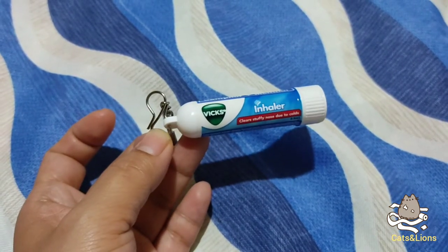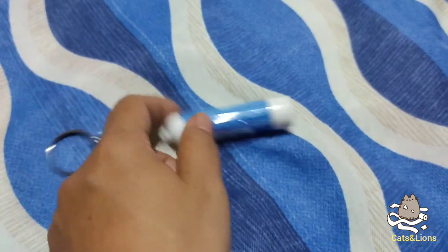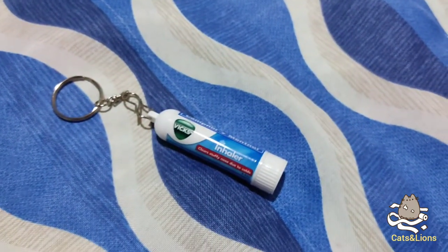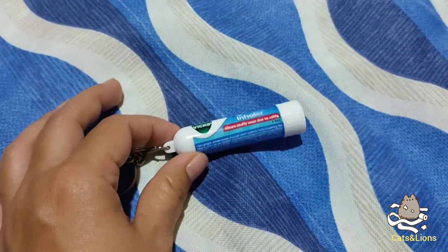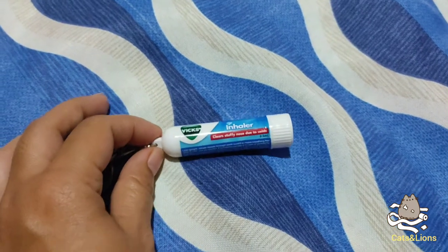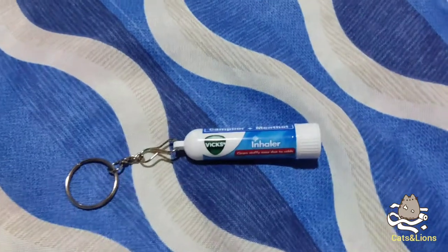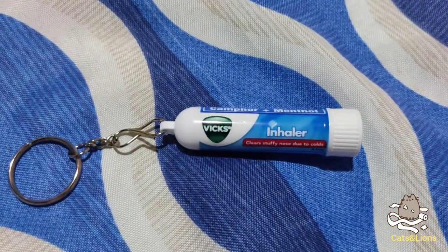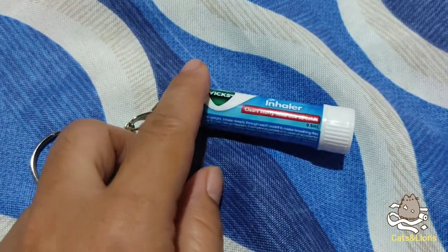They have a previous version of this one that doesn't have the keychain, but I'm not seeing that anymore, so they have this one instead, which is a really convenient package. By the way, this whole tube cost me 93 Philippine pesos from my local pharmacy store. It's not that cheap, but the relief you get is really good.